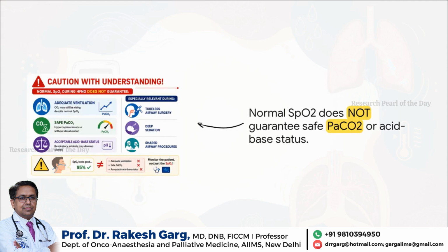So here is your final, massive, clinical red flag. You look at the monitor, and the SpO2 is sitting at a beautiful 95%. Looks great, right? Well, during tubeless airway surgery, deep sedation, or any really prolonged apneic event, that comforting oxygen saturation can give you a very dangerous false sense of security. Because while their oxygen looks totally fine, their CO2 could be skyrocketing, their pH could be plummeting, and they are silently becoming highly acidotic right in front of you.